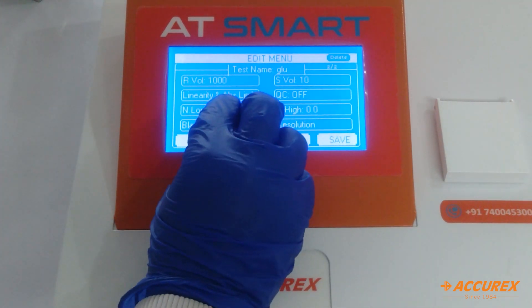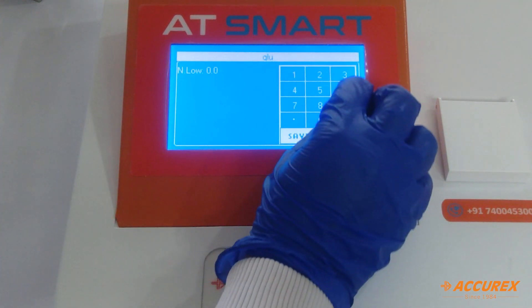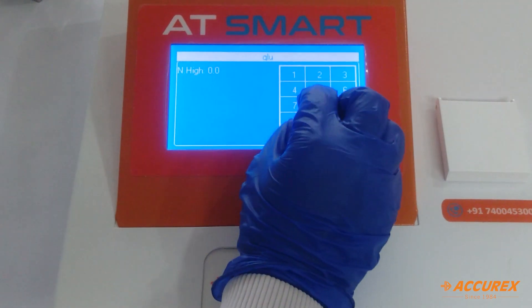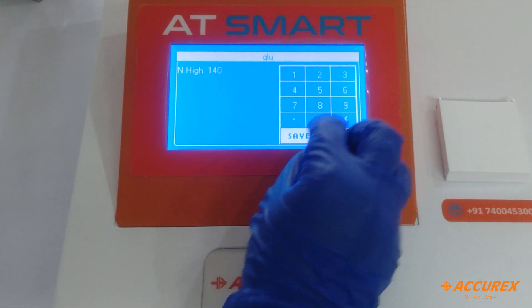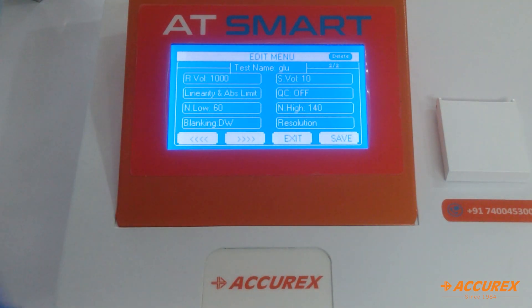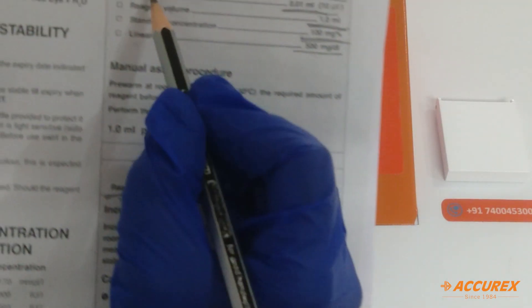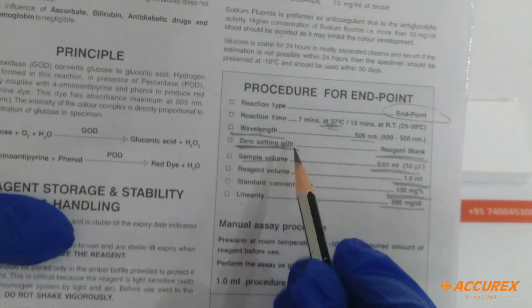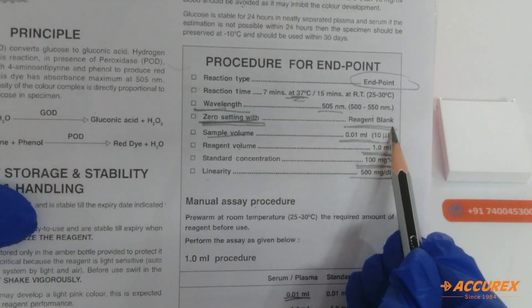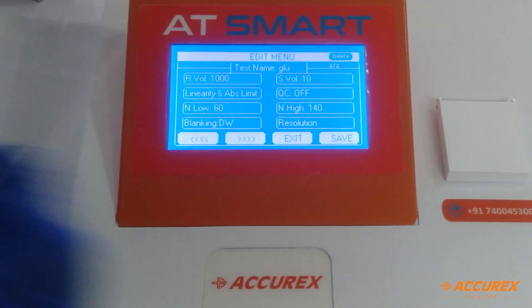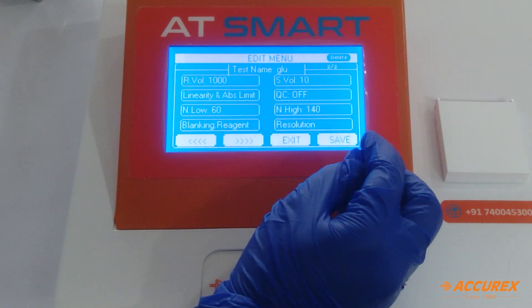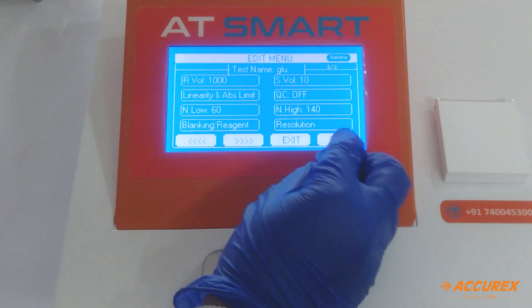Now low normal range — because it is glucose, you can select 60 to 140 and save. Blanking: because zero setting is done with reagent blank, we select blanking with reagent and save.